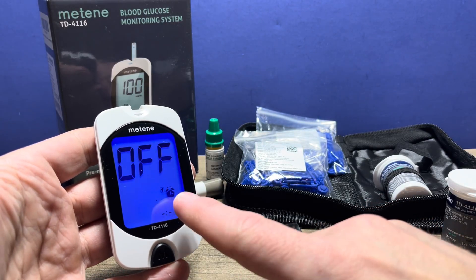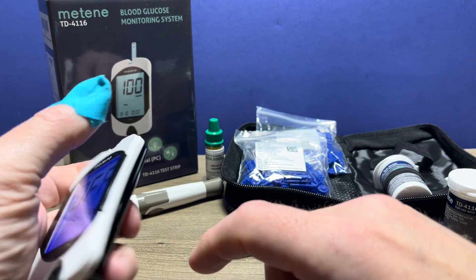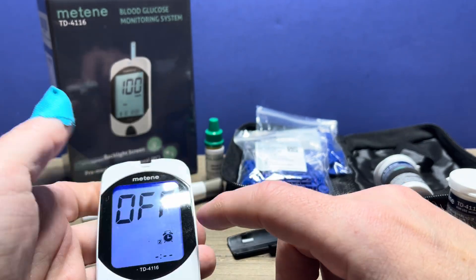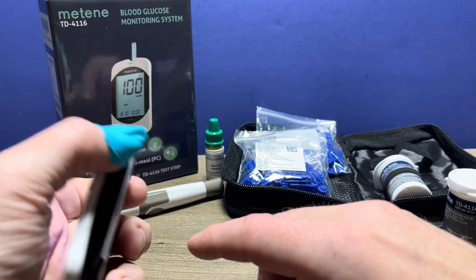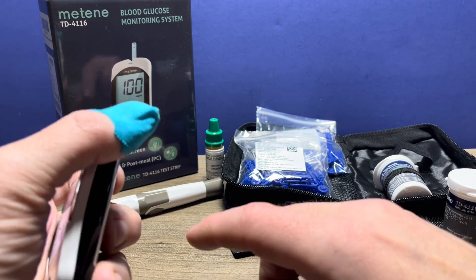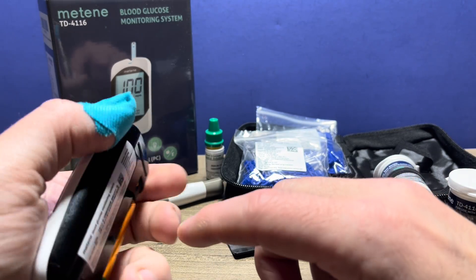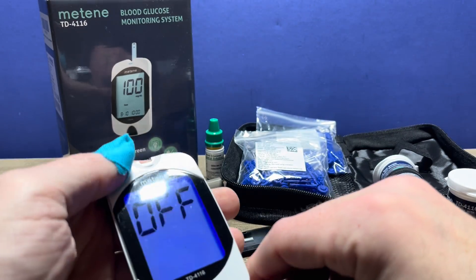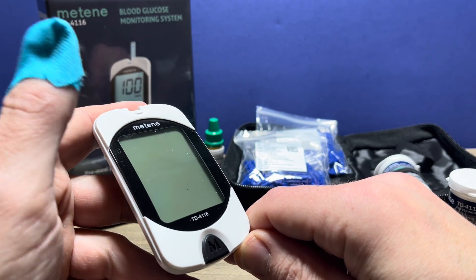Now it's ready. It does have some optional alarms as well — this is an off setting and I'm just going to leave it to that. There are four different alarms. You can switch each one to on or off and set those should you desire. And once you go through the four alarms, it is now ready to be used.